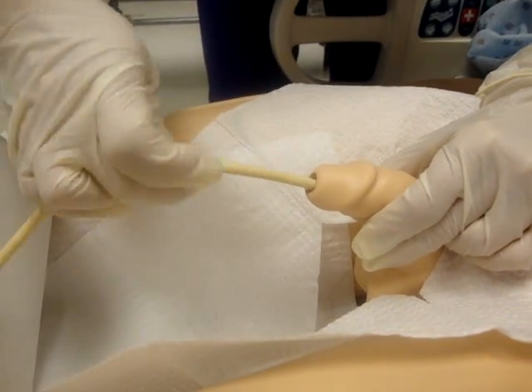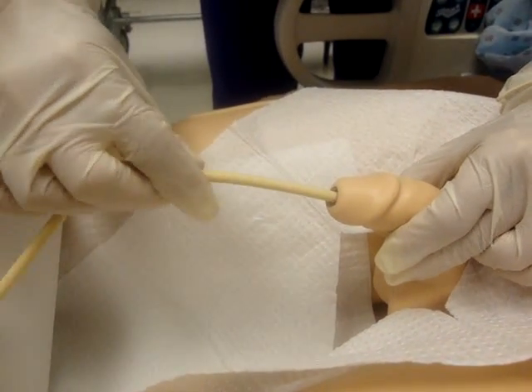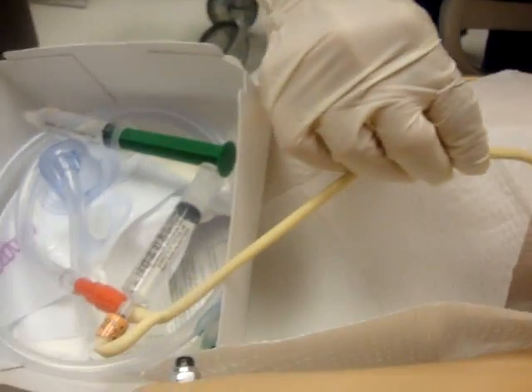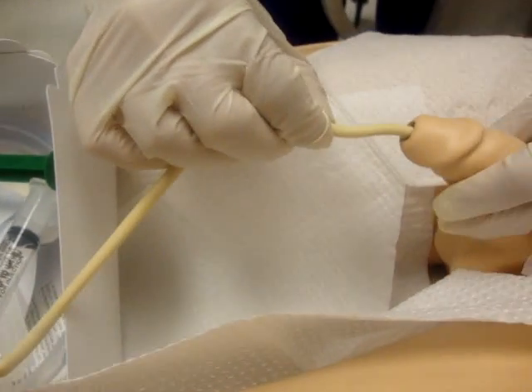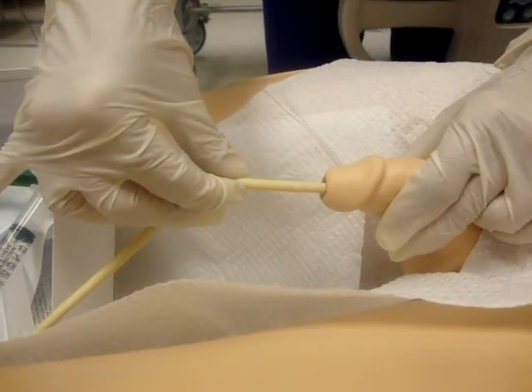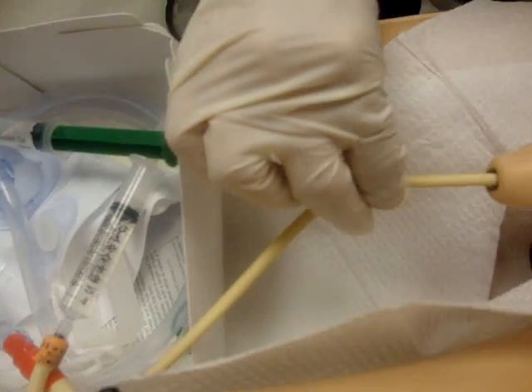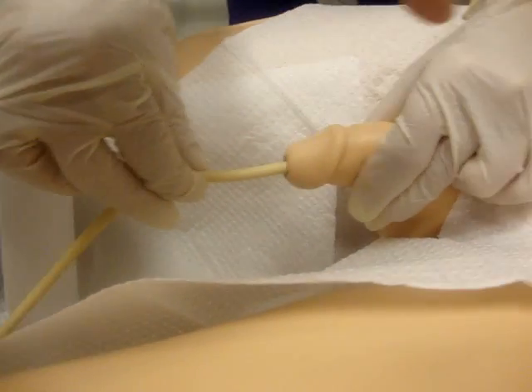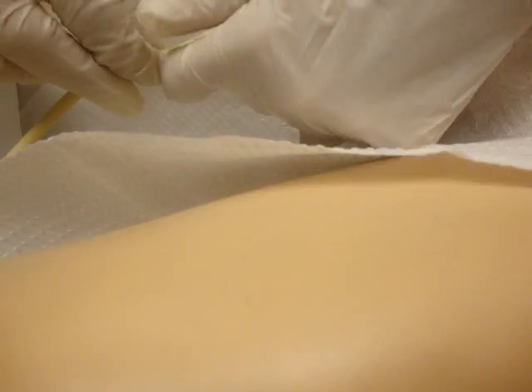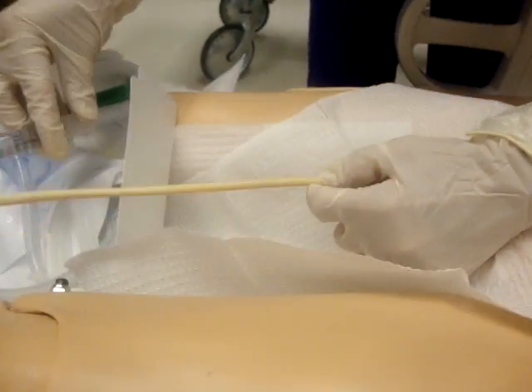You want to keep that Foley sterile as it goes in. So then we just gently push — as soon as you get close, back your hand up and push. For men, most of the time they will go all the way up to where it bifurcates. You go all the way up. If you've reached a stopping point, that's fine. What would you look for? Urine — yellow gold. You have to see it before you inflate the balloon. At this point use that hand to grab hold of the Foley at the end, not on the tip — right there — because you want to hold it in place, then inflate your balloon.